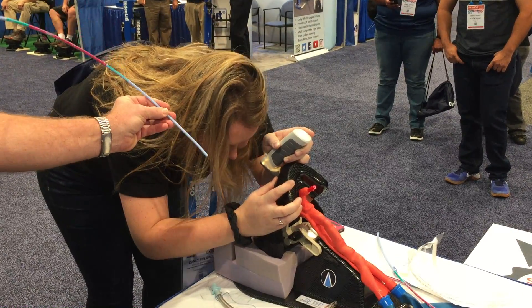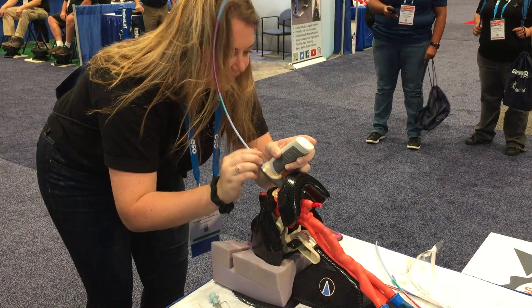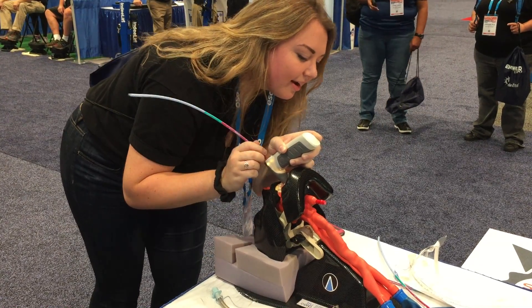And then now we're going to pass the bougie — put the bougie right through the middle. Now you also see why you should always have your hair back. I'm probably doing this wrong. No, it's fine and good.